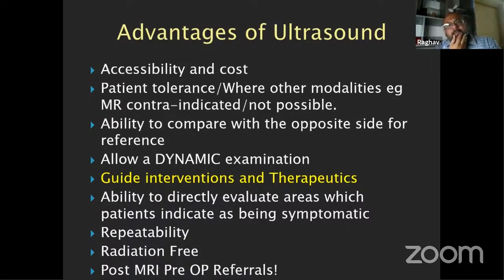And more importantly, for therapeutics, I think all of them, including Dr. Nafisa and Dr. Daftari, will be using ultrasound. So ultrasound is a primary modality for diagnosis in the emergency room, with or without the X-ray, and with the MR it will always add something. So many times I get post-MRI referrals, as Dr. Nafisa said, that sometimes we require the ultrasound. But ultrasound is like a gun: you have to be trained how to shoot it. If you're not trained, then you might land up calling a pathology normal, and vice versa.